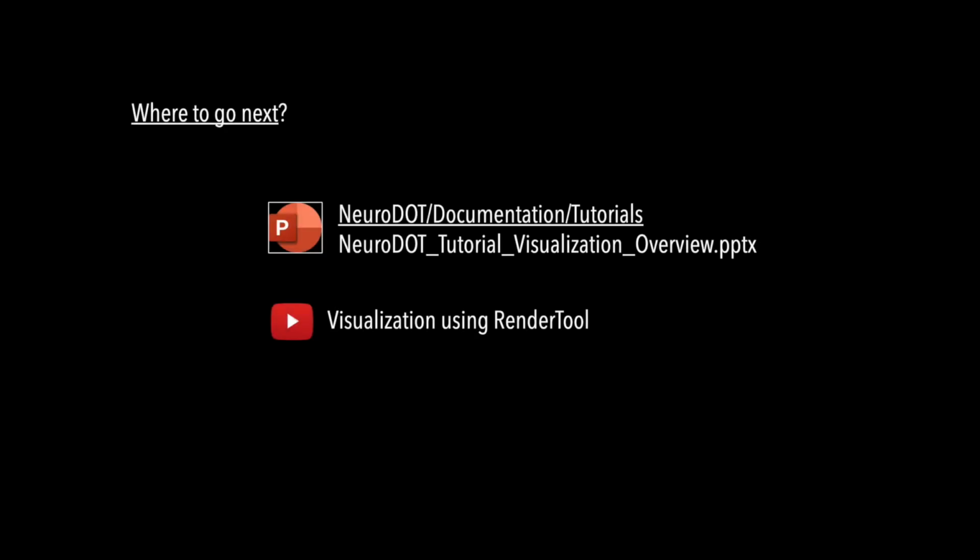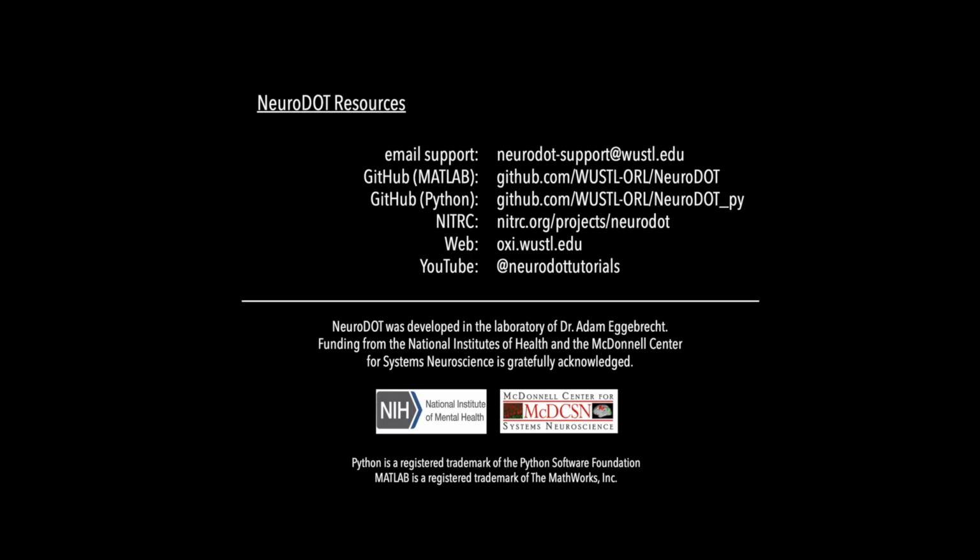As a next step, you may wish to work through the PowerPoint tutorial that provides self-guided instruction in use of the functions introduced here. A separate video tutorial is available that describes use of the NeuroDOT render tool for interactive visualization. Additional information may be found in the resources listed here.